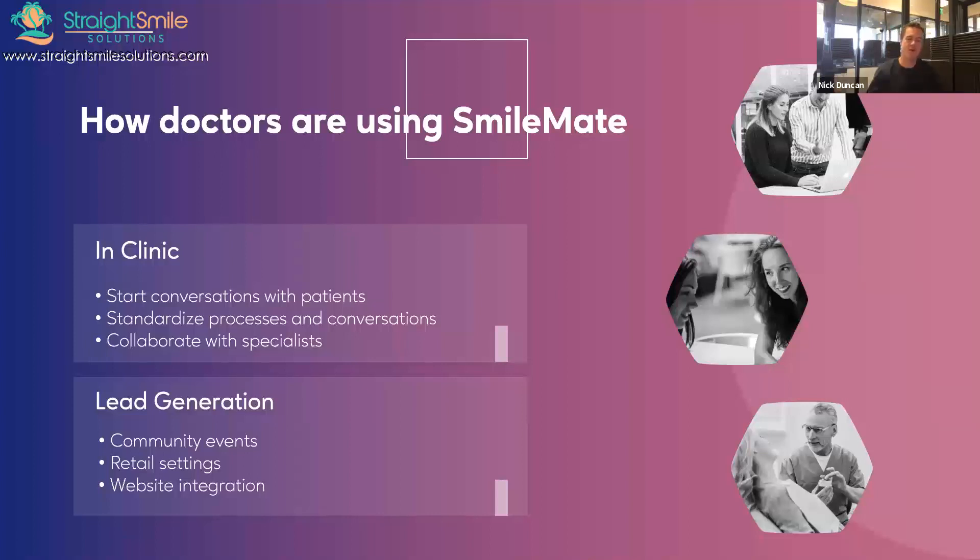It also gives your clinical partner the ability to log in, view the photos, and give direct feedback on the case. As part of the Dental Monitoring group, if the patient is suitable and goes into treatment, you and your clinical partner can monitor that patient directly — rather than sending photos manually during treatment, it creates a systemized virtual clinic where you have the oversight of your clinical partner throughout the whole patient journey.